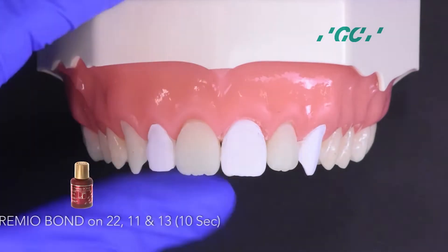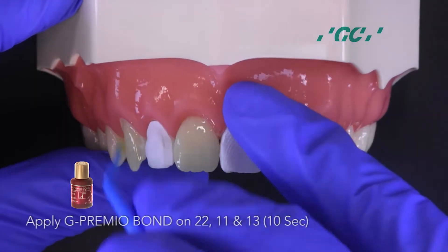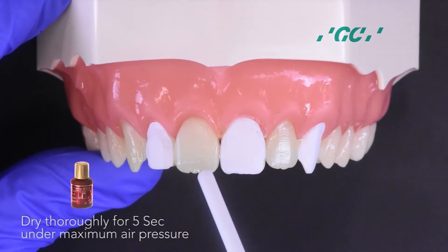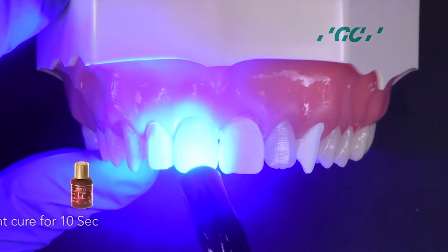Next, isolate 1-2, 2-1, and 2-3 with plumber's tape. Apply G-Premio Bond on the adjacent teeth. Dry with maximum air pressure for 5 seconds, then light cure for 10 seconds.